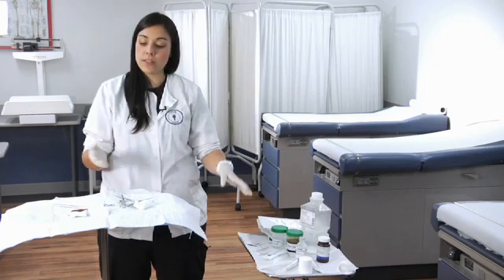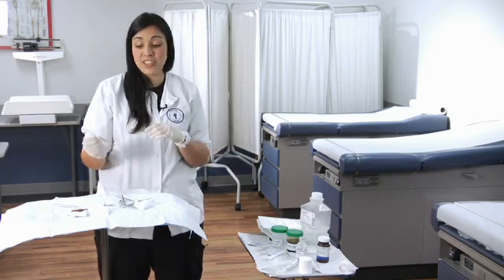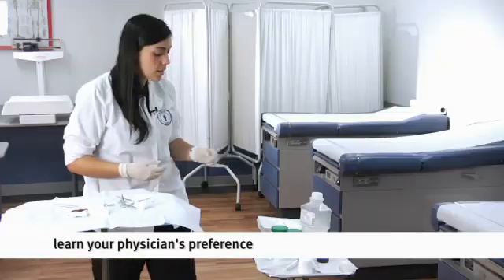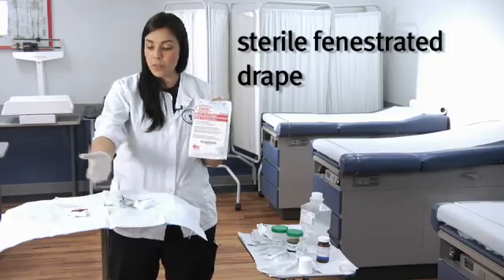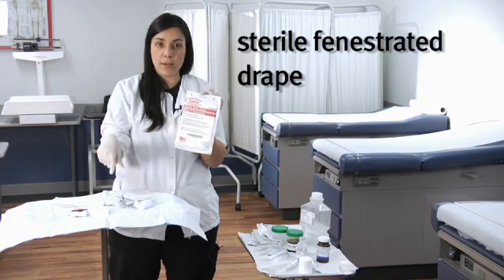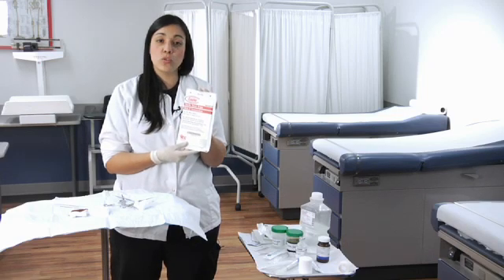Depending on the physician's preference, either they want the fluids on the tray or off to the side. Some physicians might choose to grab their own gauze and dip them into the contents. Another piece of equipment is the sterile fenestrated drape. This is exactly like the sterile field, with the only difference being a hole right in the middle. It has a little circular opening, and this is used in case the physician wants to sterilize the area of the abscess — placing it right over the abscess to create a sterile field on the patient.